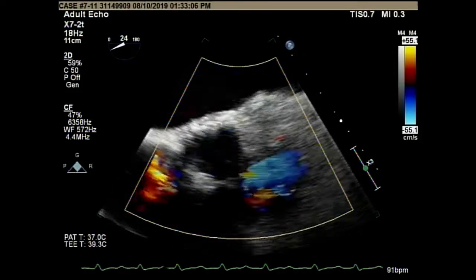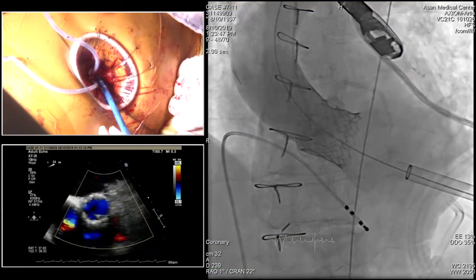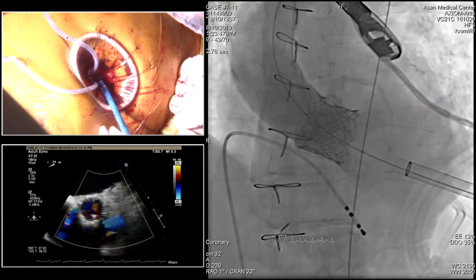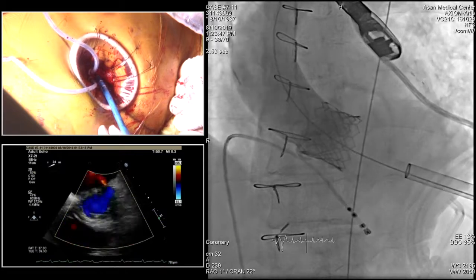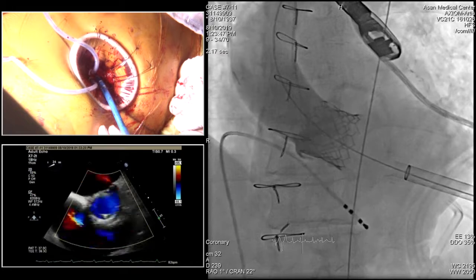11%. 우리가 지메드도 짧은 게 있어요 혹시 벌론이 하면은? See, this is when we come to PVL judgment. You know, somebody says mild, somebody says moderate, somebody says whatever. The TE is pretty much the gold standard, I think.